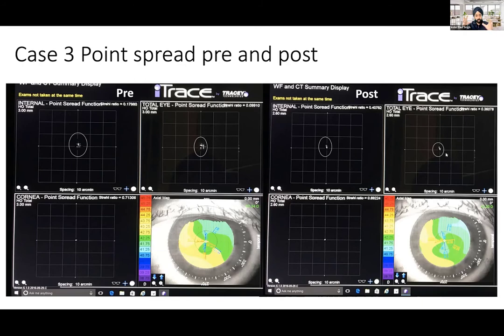And you see how more consolidated those lasers are as it hits the retina. That's the scatter from the floater. On the left beforehand, because the floater's in the middle of the vitreous, it was causing those rays of light to scatter. Right? And that's what caused the point spread function to be wider on the retina. But here, because you remove that opacity, you can see now, look, it's more consolidated as well. So this is really, I think, one of the reasons why we can now really believe strongly this is telling the truth.